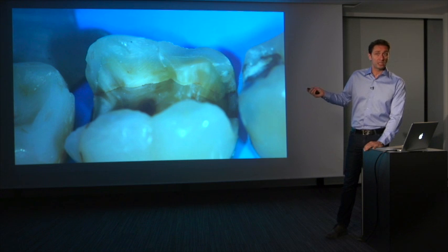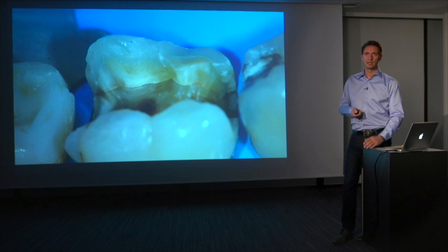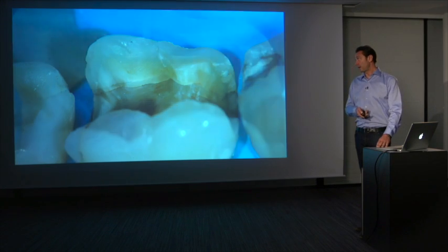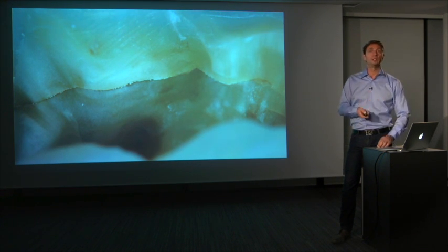And this is a patient like this. He had really some faint complaints. It was not very clear. There was some pain, but he could not tell really what was happening. Nothing specific. We really had to dig and ask him a lot of questions to get to know what the problem is or was. And simply removing the old amalgam restoration showed us a very deep crack, a very deep fracture, where you see that even the aluminum oxide particles that I used to clean the cavity stayed in the crack.